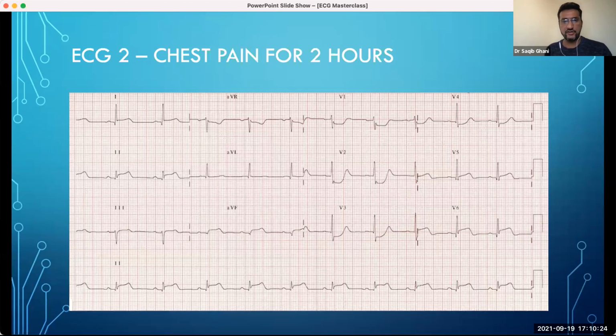Just under 10% are treating as NSTEMI. I think they're looking at the anterior leads, V1 to V3. 8% are saying give aspirin and ticagrelor. That is the right thing to do anyway. I'm glad no one is waiting for outpatient assessment here. Some of you are saying admit via A&E and check troponin.